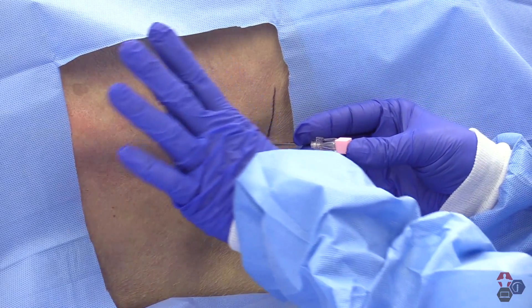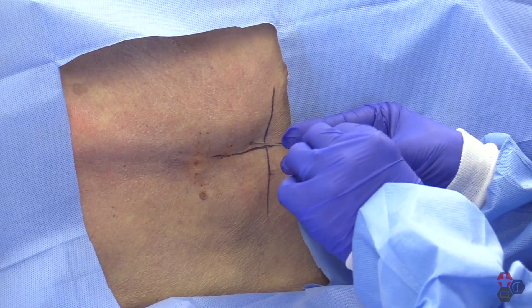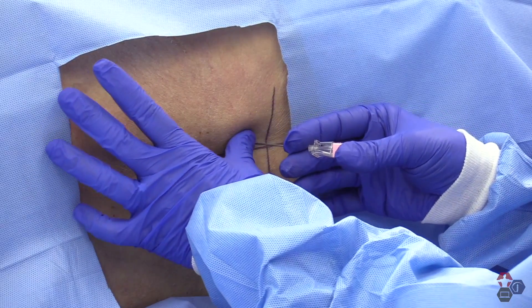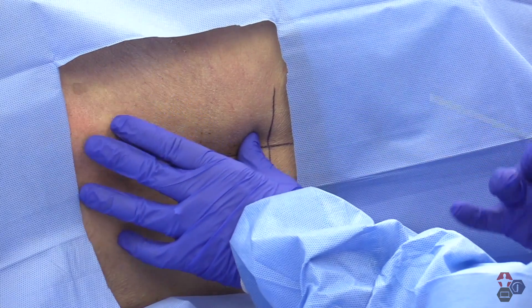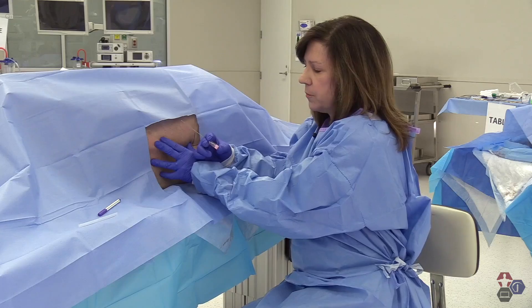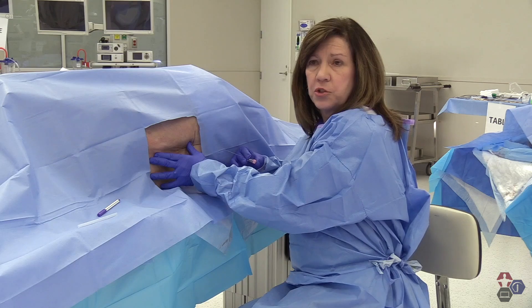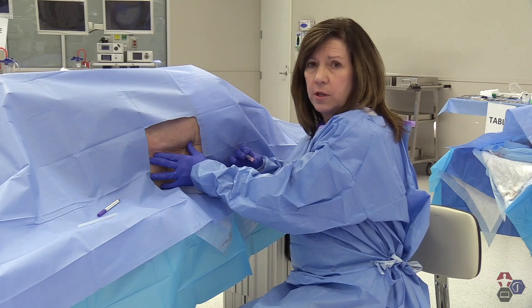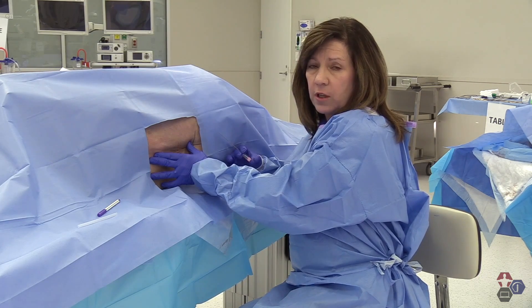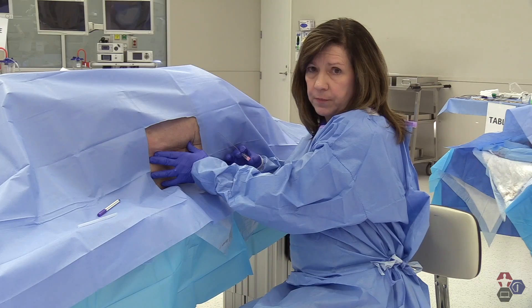After the procedure, you return the obturator to the needle and pull the needle out in one swift motion. I usually apply digital pressure to the puncture site for at least a minute to make sure there's no major bleeding.